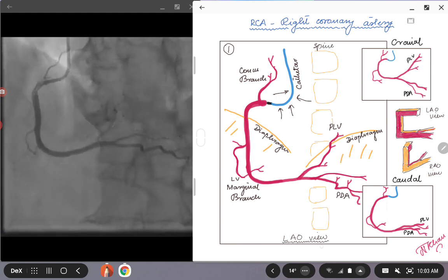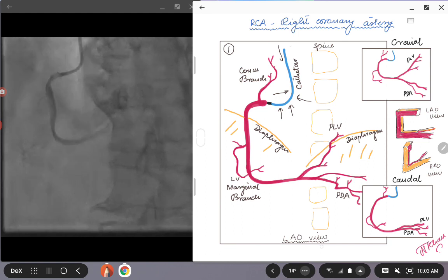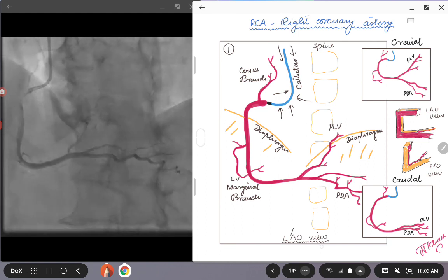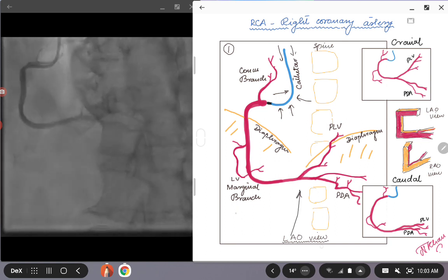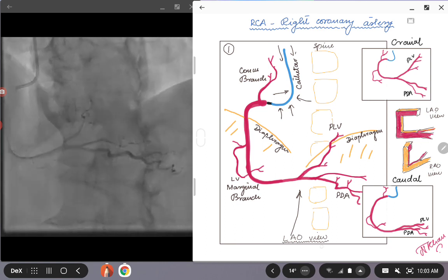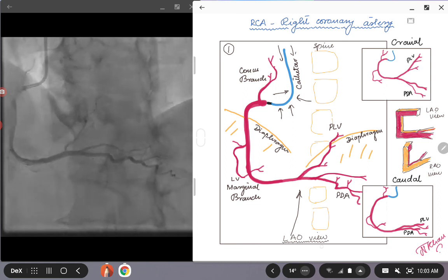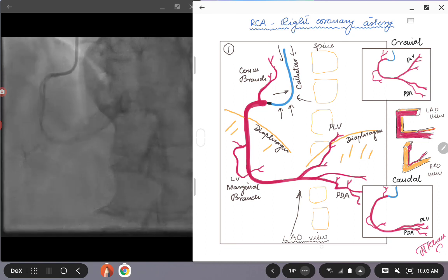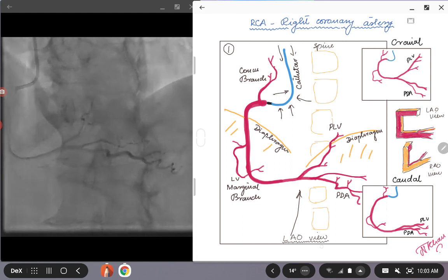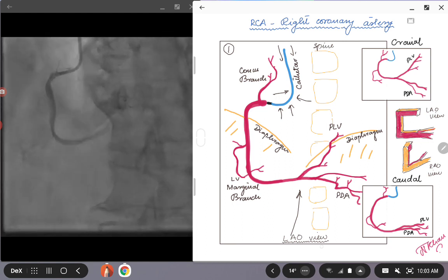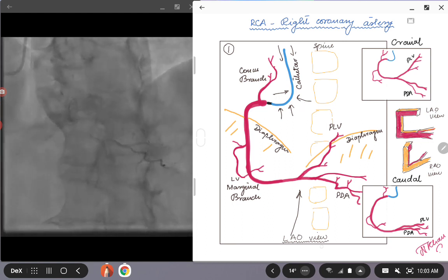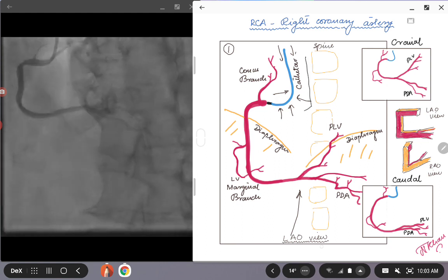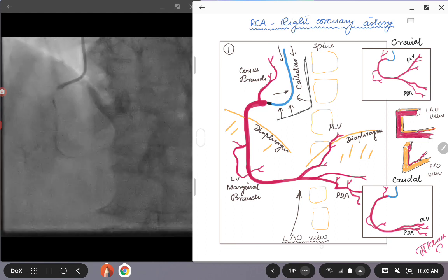If you look at this picture one, you see that the catheter is coming from the top. You don't see anything coming from below the diaphragm as we saw in the left system, so this is probably a radial access for the coronary angiogram. And as we learned from our left system coronary angiogram, since the catheter is opened like an L, that's probably an LAO view.